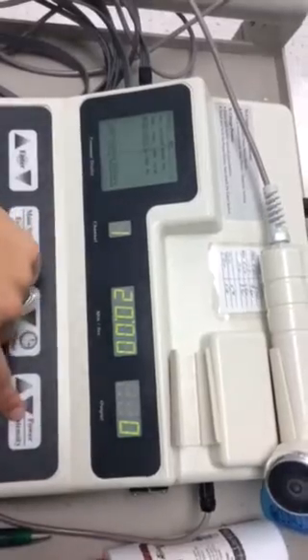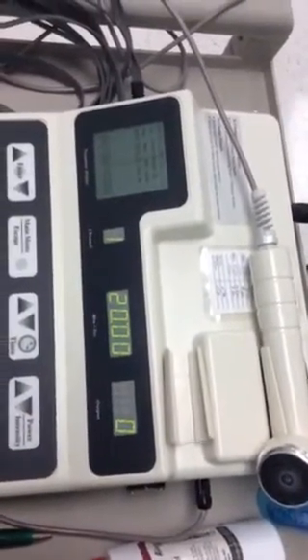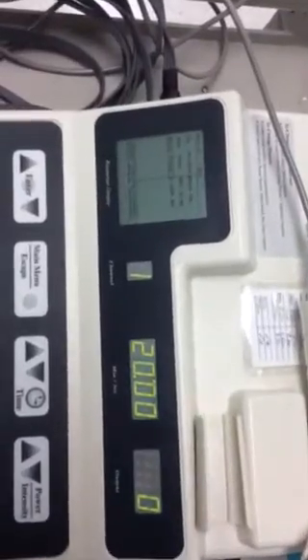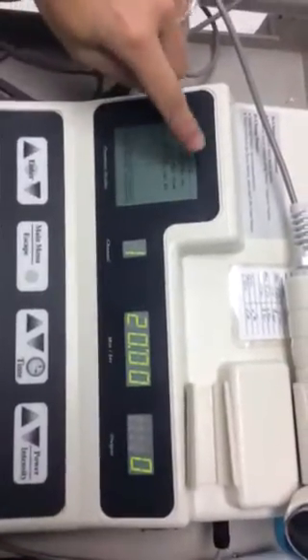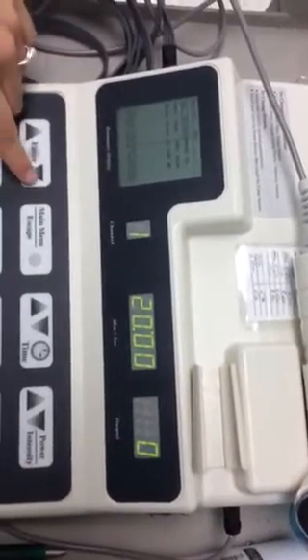Once that intensity is set, press start, and the time will start counting down. And make sure you know which channel it's on. So both channels, yes, for IFC. IFC should be both channels, however you can change it.